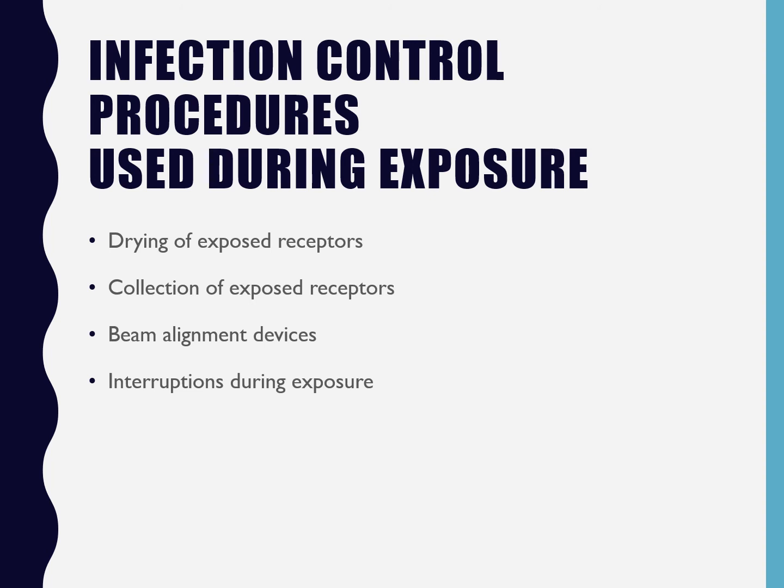For film, every time you take a film out, obviously you have to walk back over. And so with that one, I want you to have either a cavity wipe out or a paper towel that has spray disinfectant on it, and you're going to wipe off the saliva on the cavity wipe. That way, not only is the film drier, it doesn't have saliva on it anymore, but we're also cleaning the film just a little bit. It's not going to sterilize it. The film is still contaminated, but we are going to wipe off all of that extra with a little bit of a disinfectant, and then we're going to put it in a cup.